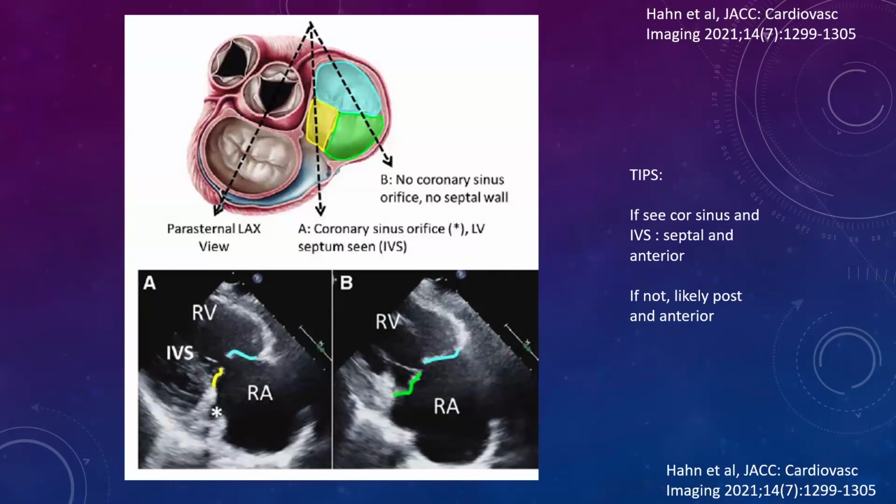And again, these are lovely pictures from that paper from Rebecca Hahn. She just put her name on my talk, I suppose. So these are nice because we're able to see how we're cutting through the structures and then which plane we have in terms of the view.